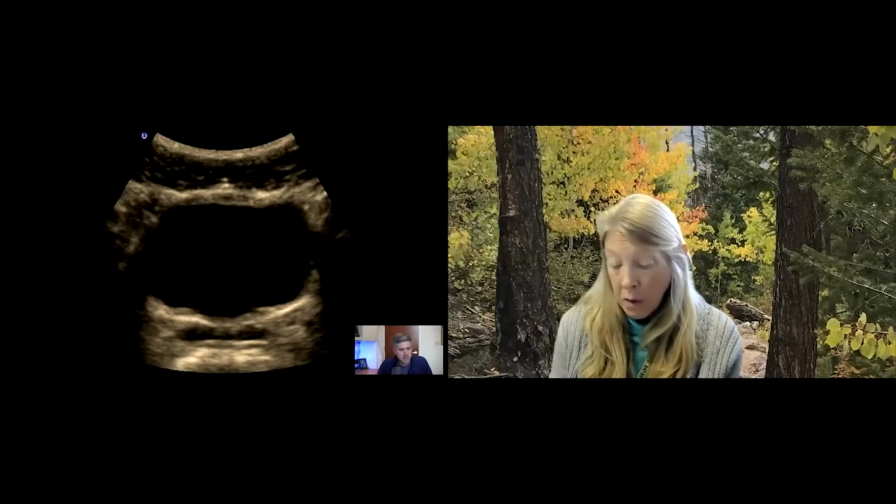And from the sonographic standpoint, here's a transverse-oriented ultrasound. You can see the anechoic fluid collection that is the bladder, right? And then you see this dark, decently anechoic stripe just deep to the bladder, and that is the seminal vesicles, right? And it's a great example of something that you can look for. That's a normal landmark or normal anatomy that you'll see on these patients.